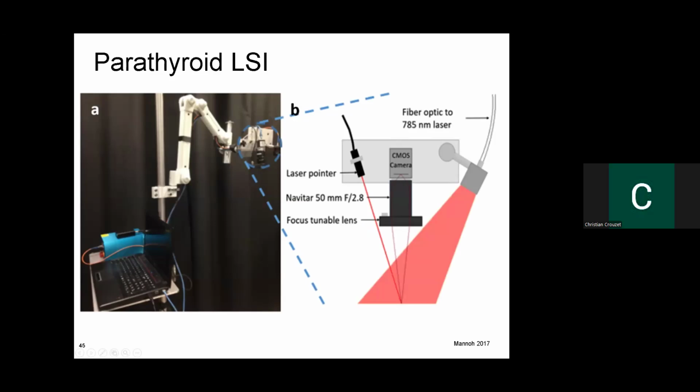This one here, I believe, wait, what's this one? This one here was actually the laser to do the speckle. This laser was more for positioning, I believe. So knowing where you are shining your laser allows you to see, hey, I'm in the right position, because you don't want to be too far out of focus one way or another. Knowing where that laser pointer goes, it's able to say, hey, we're in focus. We can collect data at this location.